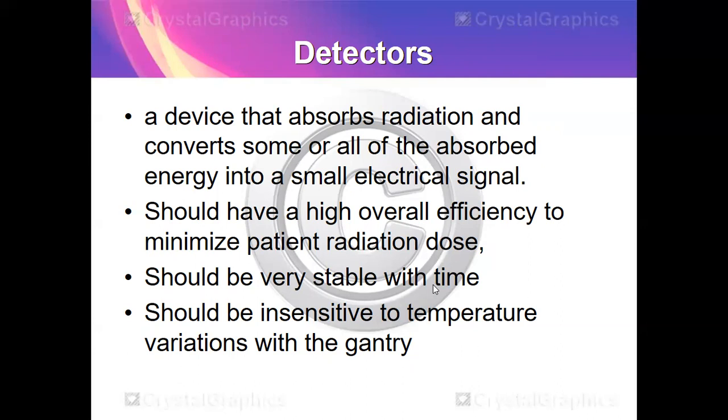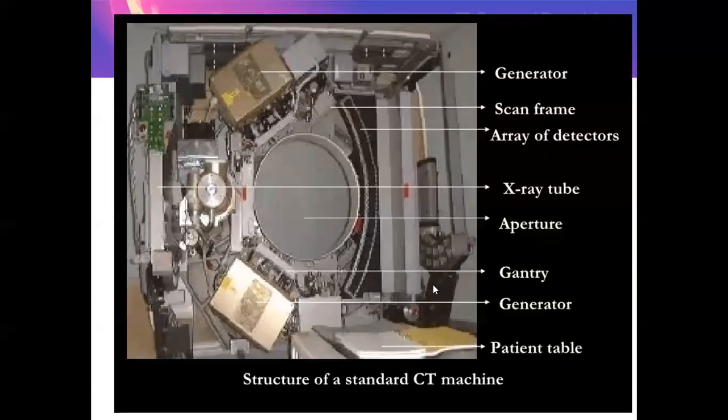So, dinidetect niya yung X-rays na galing sa patient. Kasi di ba, i-expose ang patient, tapos yung useful or remnant radiation na mag-exit sa patient, i-detect ng detector para may image tayo.